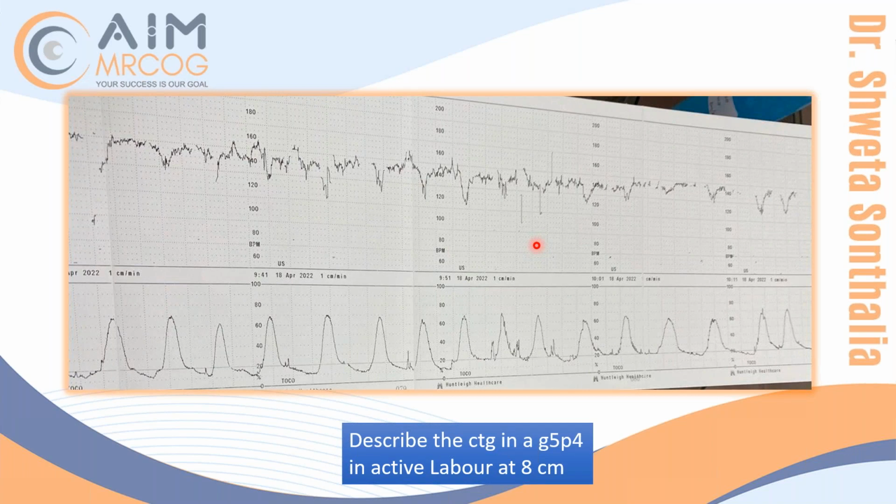So it's variable deceleration. If it is variable deceleration for more than 90 minutes, I'm going to be worried, even if there are no concerning features. Though if you see, it is with concerning feature here, right? Here there is shouldering. Here again, it is not there. So it's with concerning feature. If it is with concerning feature, 30 minutes is enough to label it pathological. So be careful in exam because early and variable sometimes become very intermixed and we get confused, but it's variable.